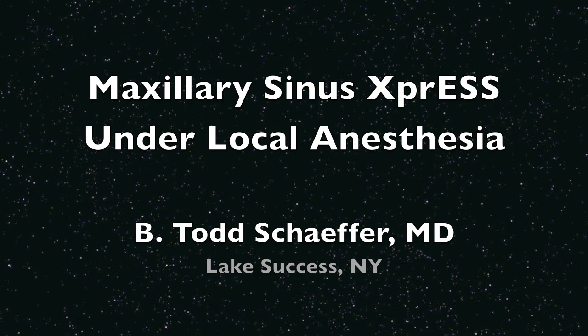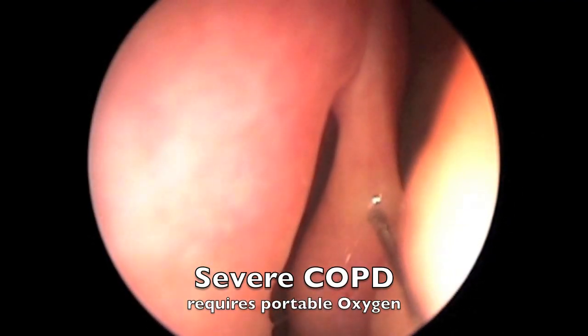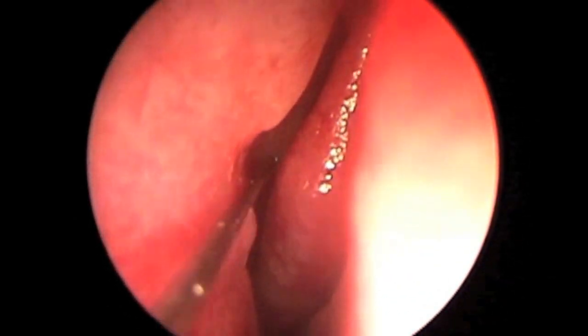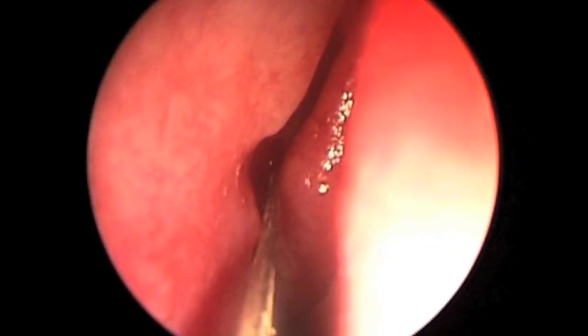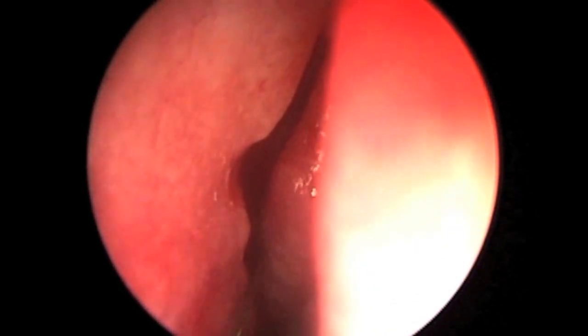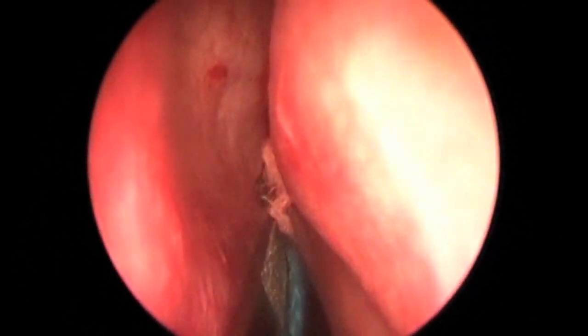Maxillary Sinus Express is performed here under local anesthesia. This patient has severe COPD and requires portable oxygen. Here we are injecting the lateral wall of the right side of the sinus. The patient has mild to moderate maxillary sinusitis on CAT scan. He cannot undergo general anesthesia, and therefore this is an ideal candidate for this procedure.